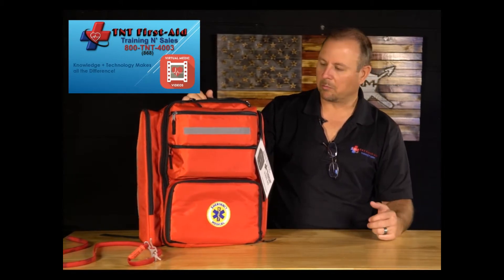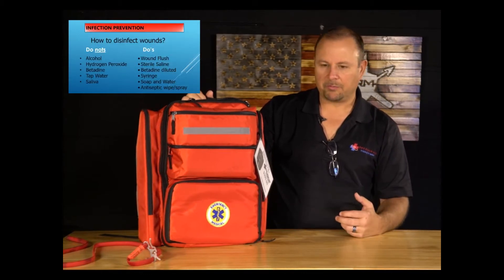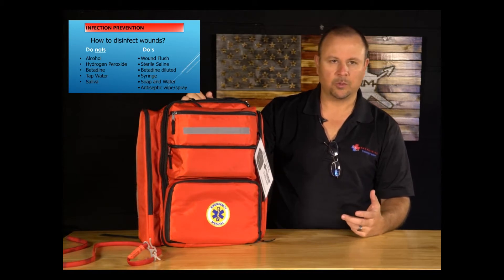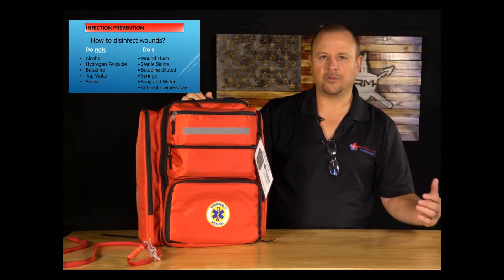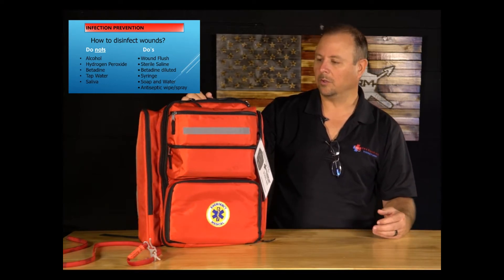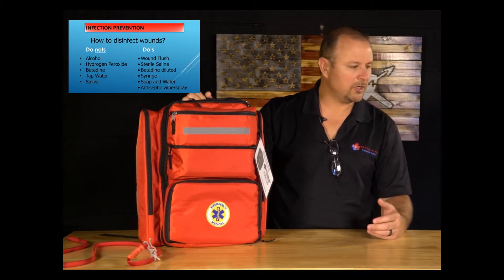We're going to have a PowerPoint going as we go through this kit. A lot of things people do wrong are cleaning and disinfecting wounds, or using the wrong products. On the do-nots list, a lot of people are guilty of using alcohol, hydrogen peroxide, betadine, tap water — and they think that's cleaning the wound. But using alcohol on a wound is actually toxic to the tissue; it burns and hurts.